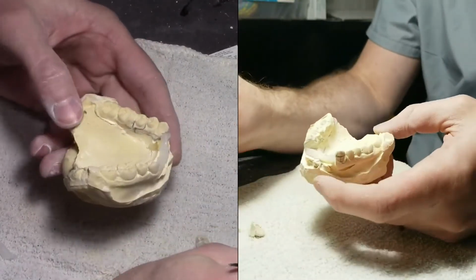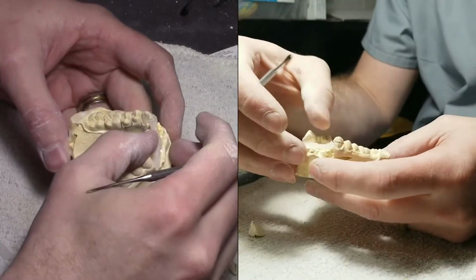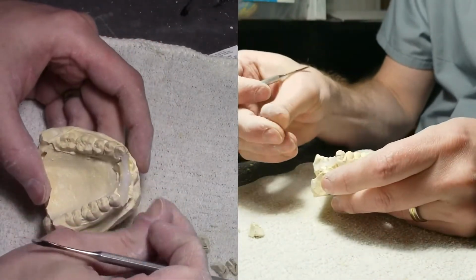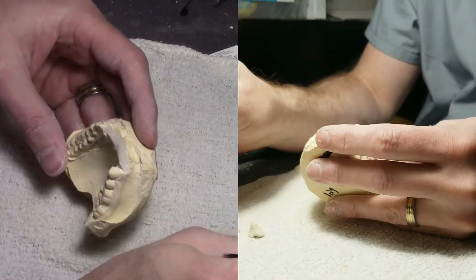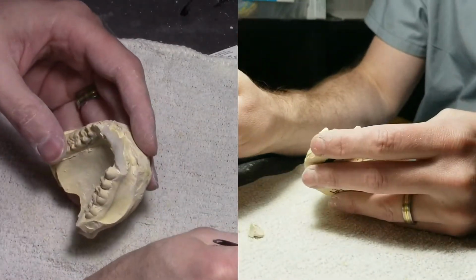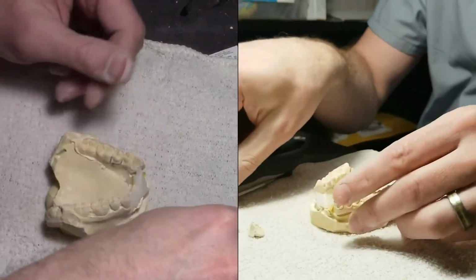Moved on me a bit. Probably need a little bit more. You can also rub it between your fingers. So this is utility wax, not sticky wax. This is utility wax. This is sticky wax. Alright.